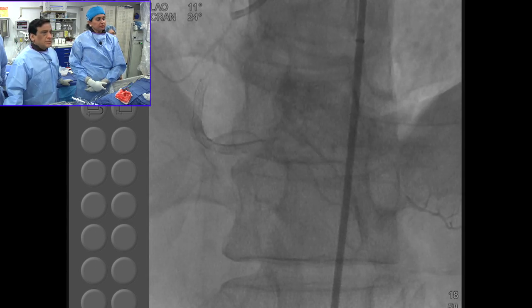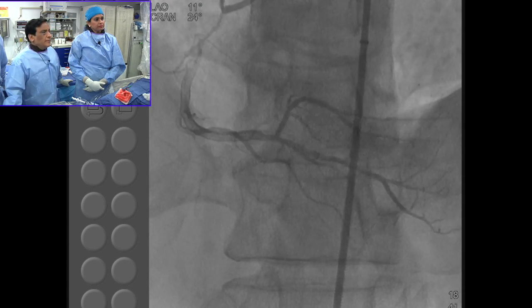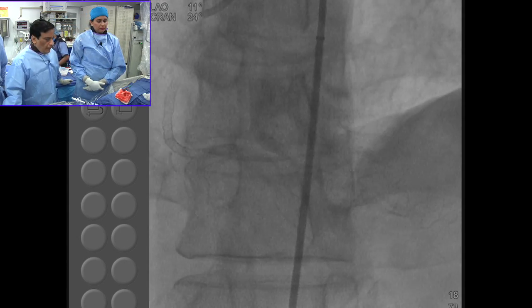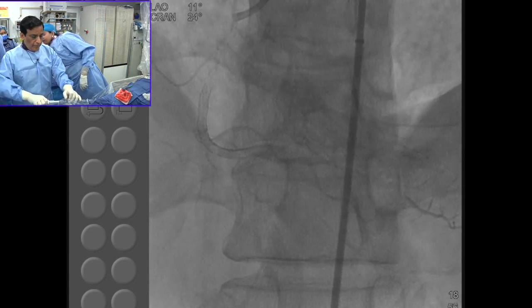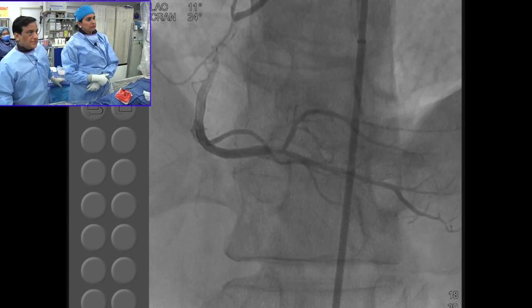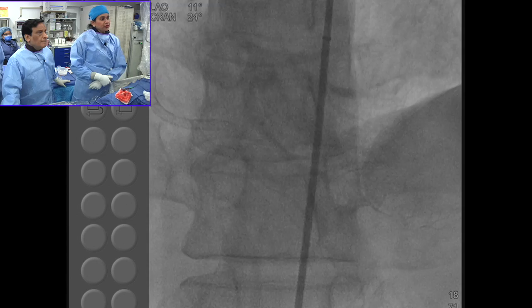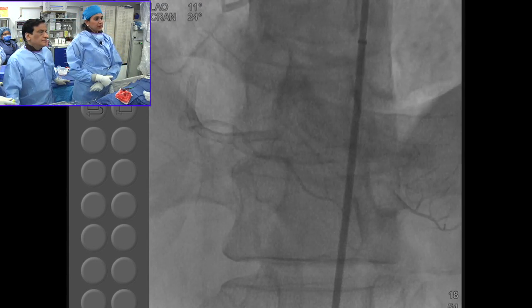There's a mild disease proximally also. I mean, this is right. You can decide in the future too. Many of us will put another stent there across and take care of it, unless you do IVUS and have shown that there is no dissection and your lumen is still okay. This is a big step down. Yeah, 3-0 was, I think, too big a stent for that vessel.